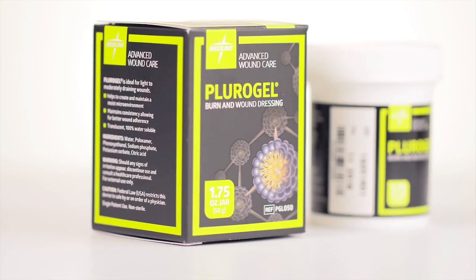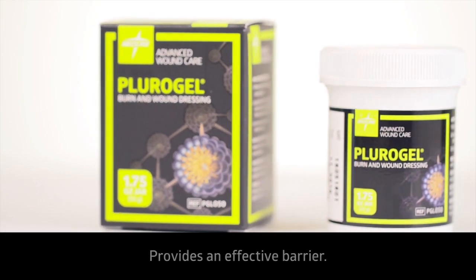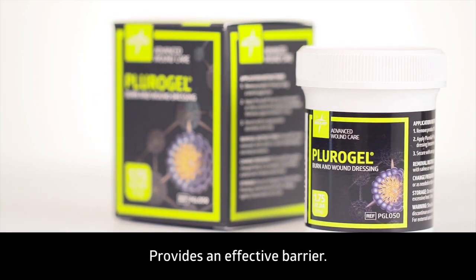PluroGel is a water-soluble burn and wound dressing that helps to soften and loosen wound debris as well as maintain a moist wound environment that promotes healing.